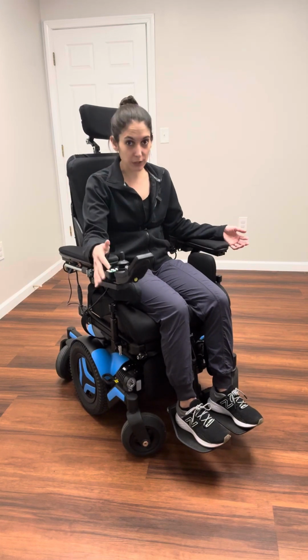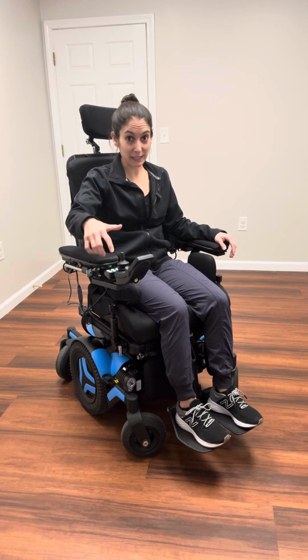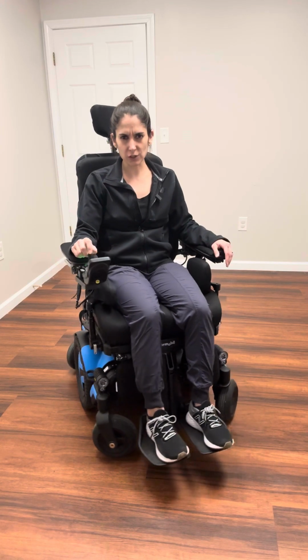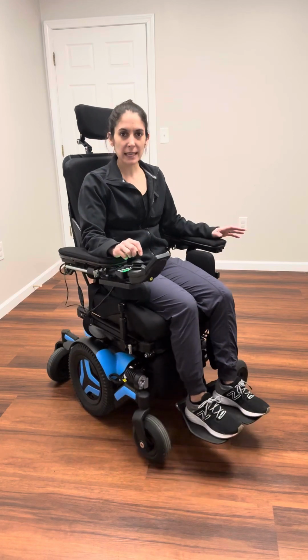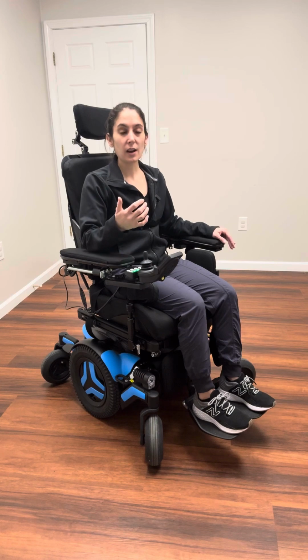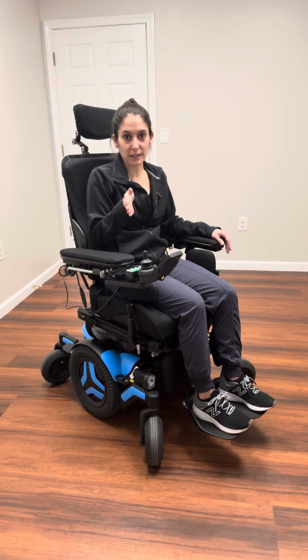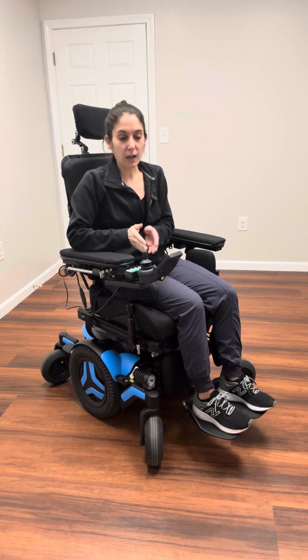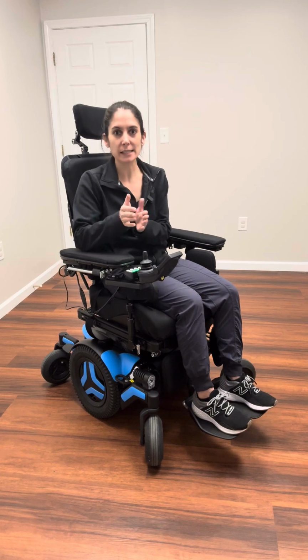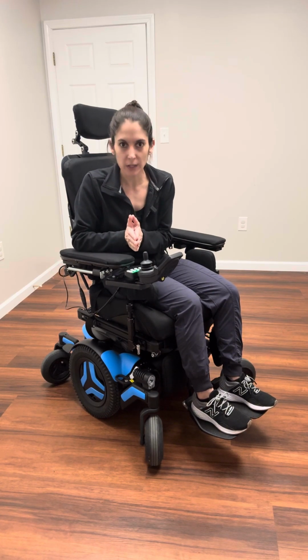Now, for a front-wheel drive chair, the pivot point is in the front of the chair. So as you're turning, more of the chair is behind you. And even though it does have a bigger turning radius, it has a better turning aspect. And that is the ability to be able to turn 90 degrees, to navigate very, very tightly around, say, a couch or a table.